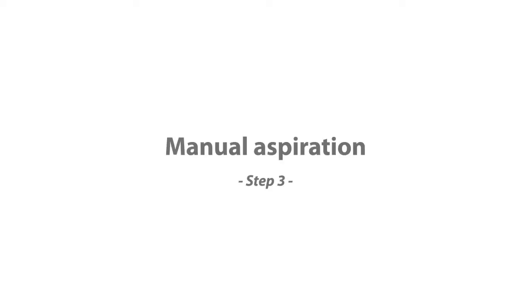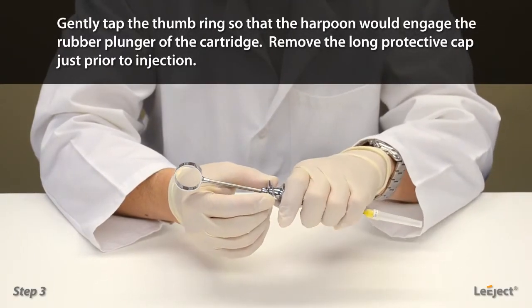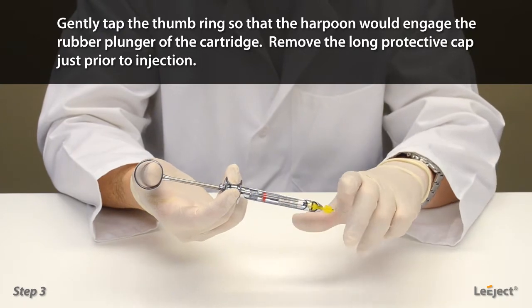Manual aspiration: gently tap the thumb ring so that the harpoon would engage the rubber plunger of the cartridge. Remove the long protective cap just prior to injection.